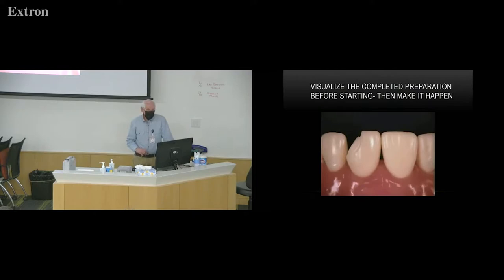The only thing I'm concerned about is that sometimes students will get a little carried away with the axial reduction and go over a half millimeter. Take it easy. We want to keep it in enamel. We don't want to be into the dentin.